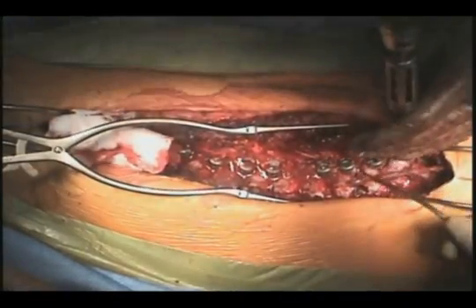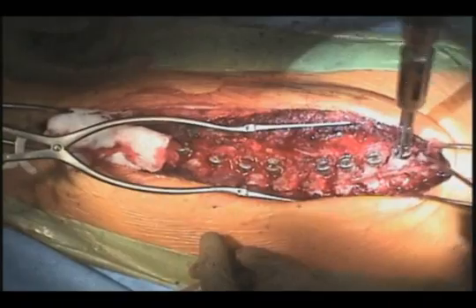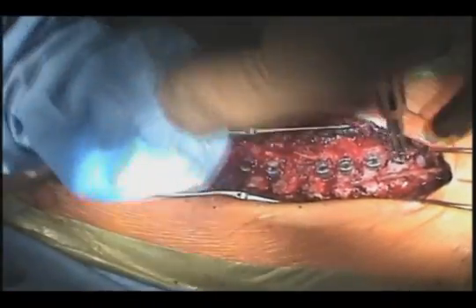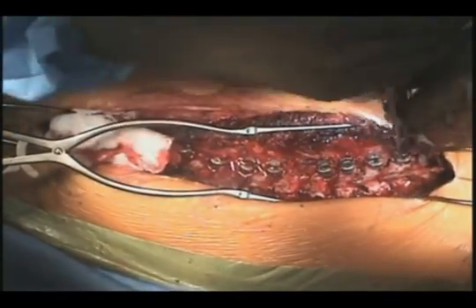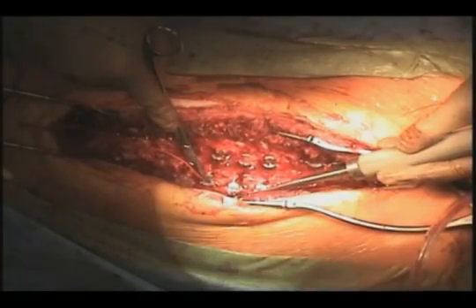And we find that if there's a bilateral diminishment, that is often a sign that blood pressure is low, or that the patient's hemoglobin may be low, and so we adjust pressure and hemoglobin and fluids based on that. Again, you can see here the harmonious alignment of the screws.